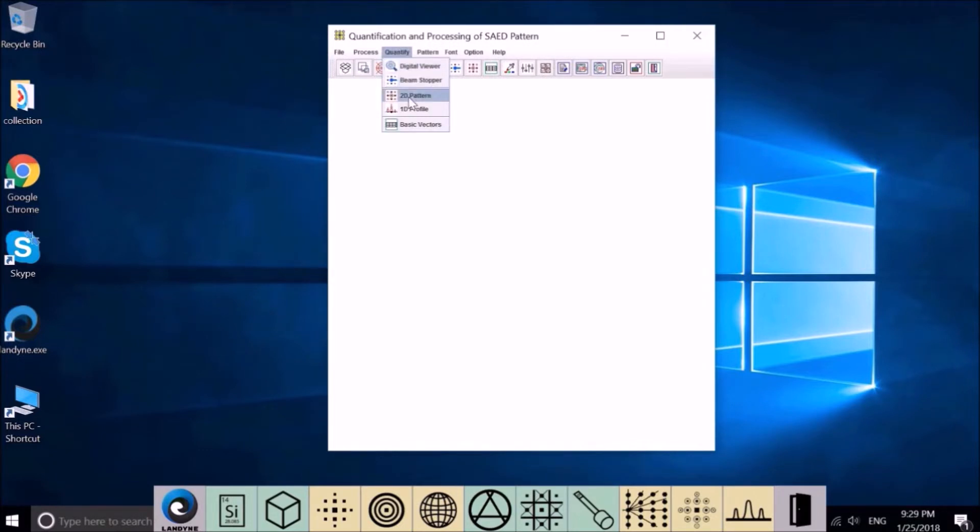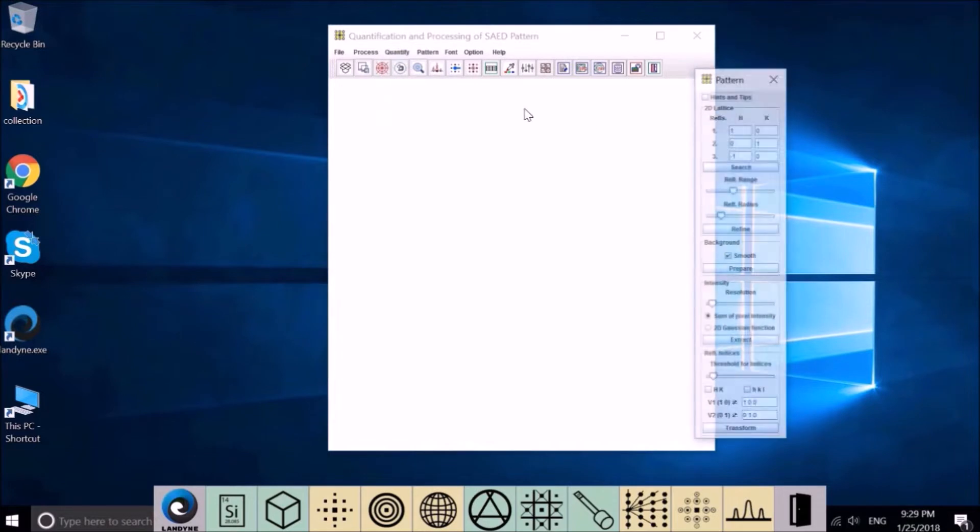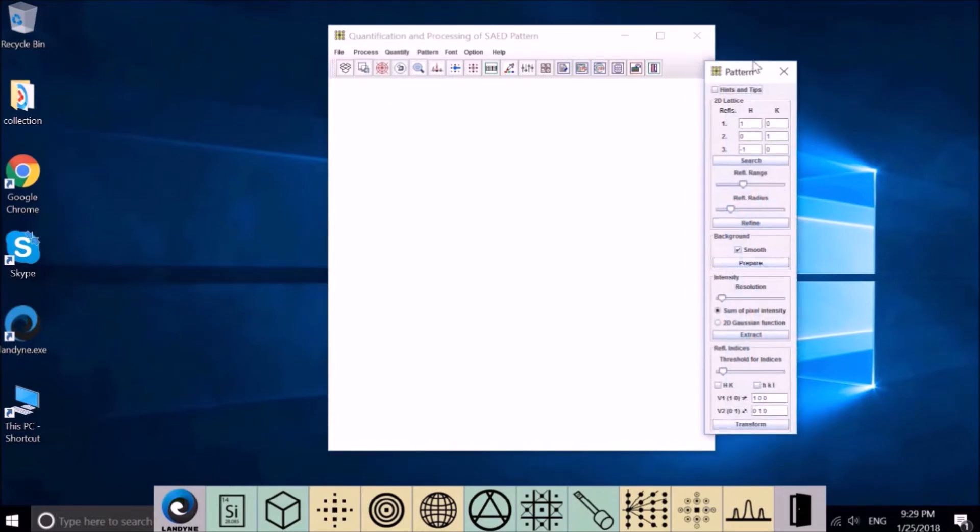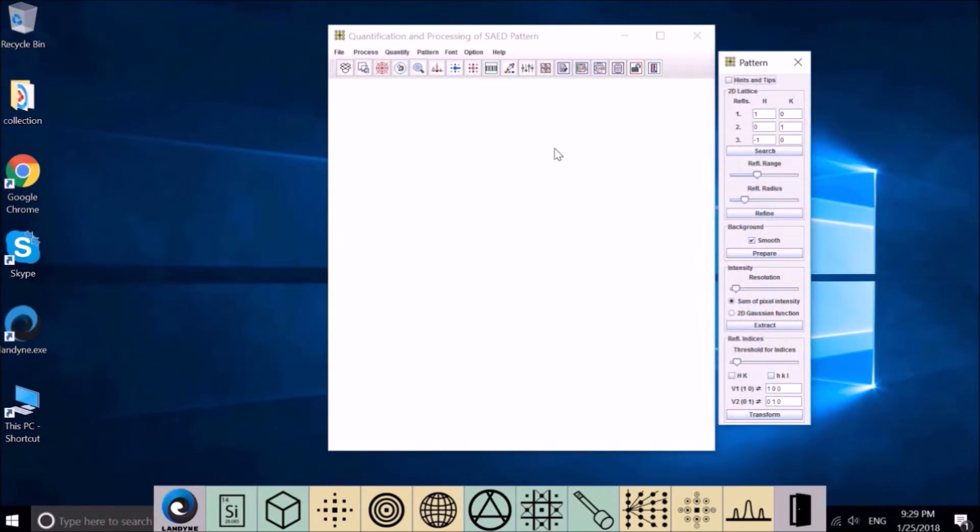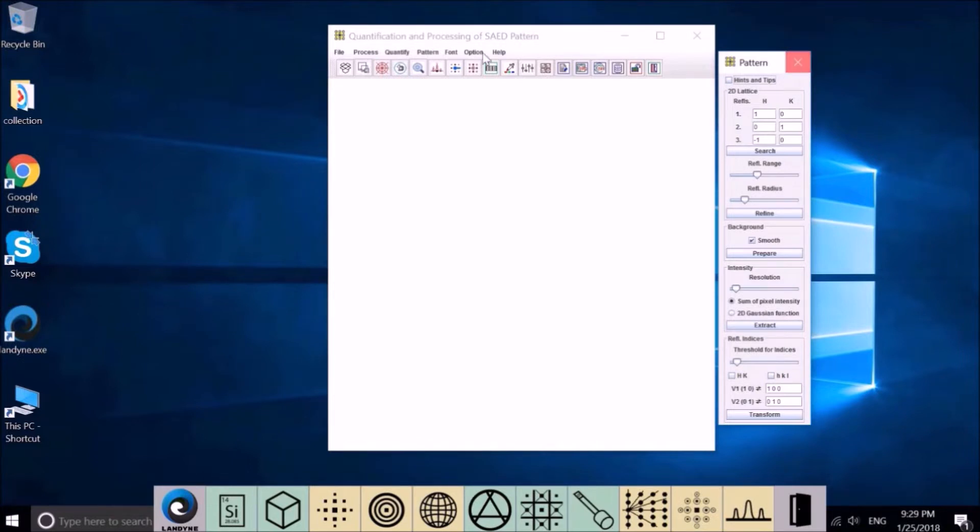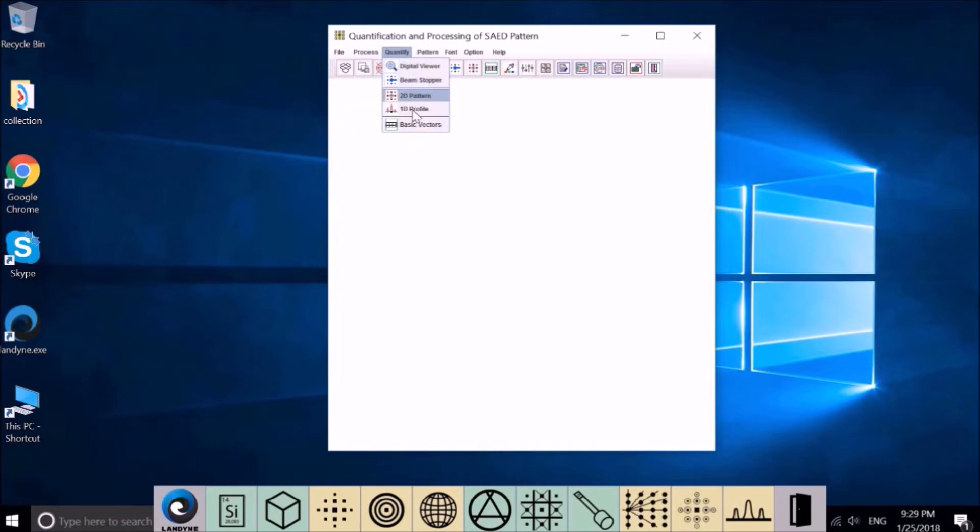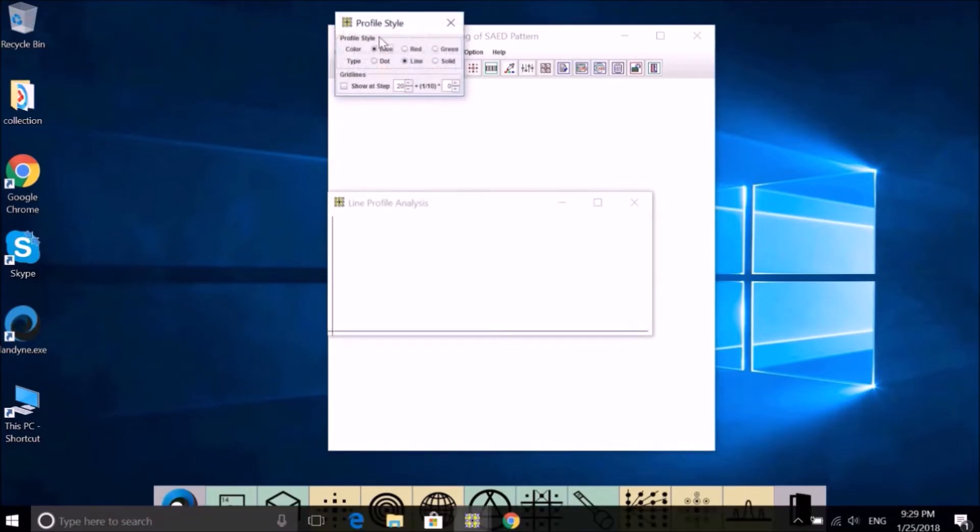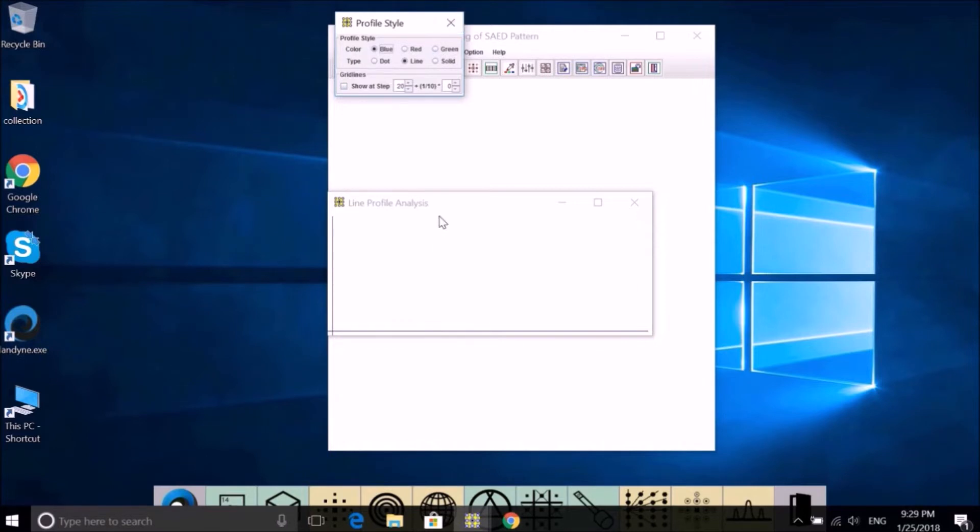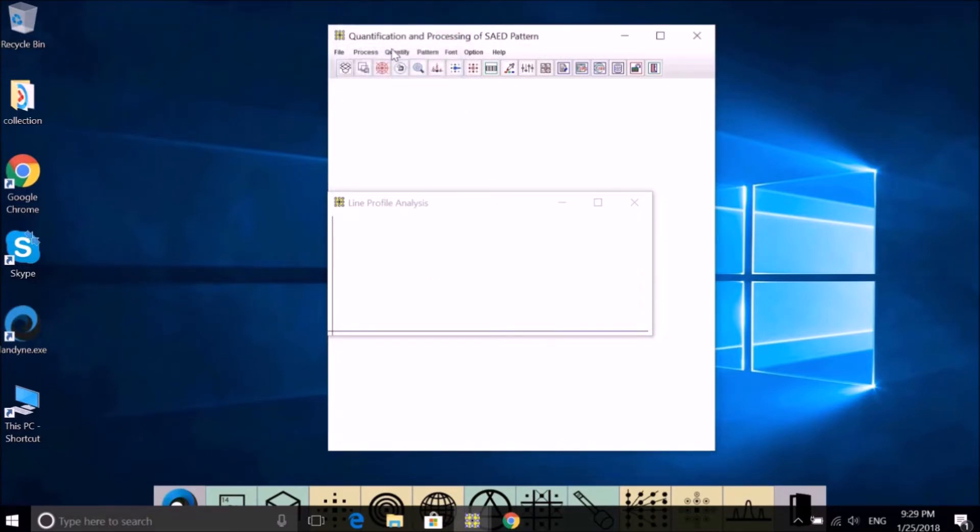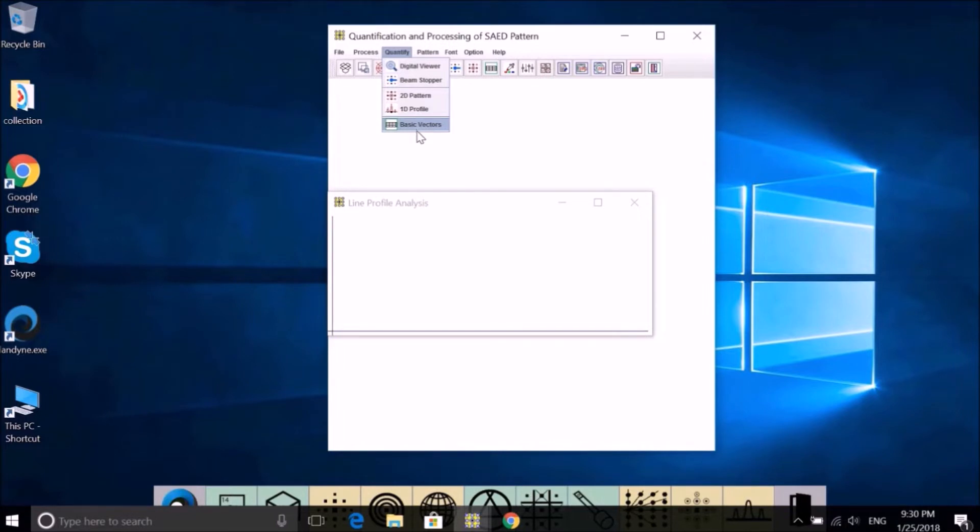2D pattern - this is the main function for QSAD to retrieve the intensity. 1D profile - this is another function to retrieve the intensity, mainly to get the length between two diffraction spots. The last one shows information of basic vectors.